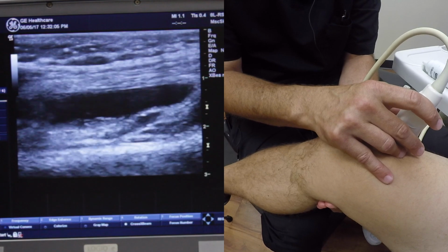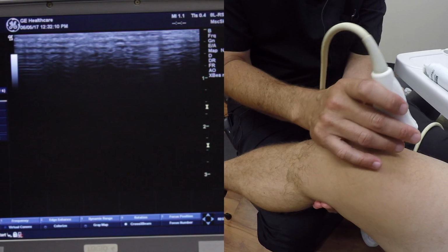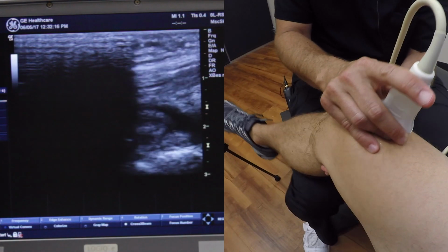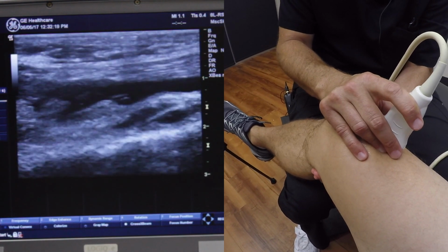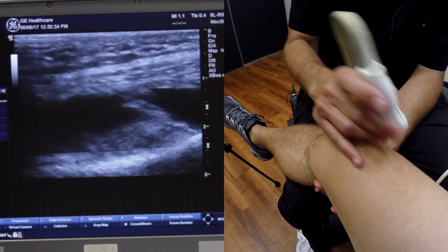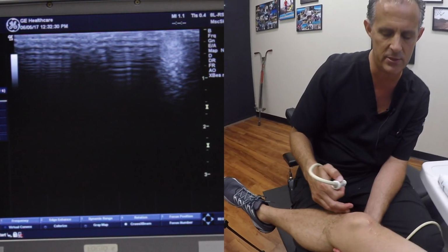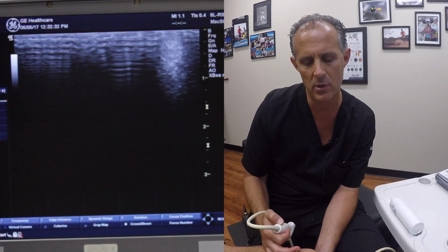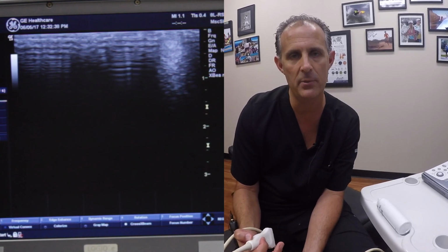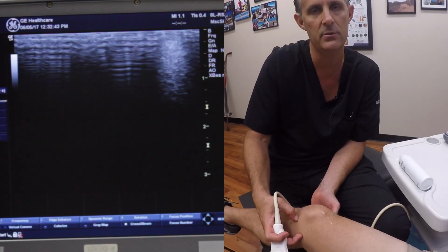Normally, a patient will feel a tightness or a limited range of motion. I can actually feel a little crepitus with my palm as I have my hand over your knee. Yeah, I could feel a little creaking and some crepitus going on, which is typical with this kind of fluid. So what kind of conditions usually go along with this type of finding? You'll find this oftentimes with internal derangement or things like meniscal damage. Any type of problem in the joint will cause a pooling or a collection of fluid up in the suprapatellar region. The fluid has to go somewhere. So it doesn't really have much opportunity to go anywhere on the medial or lateral side of the knee.